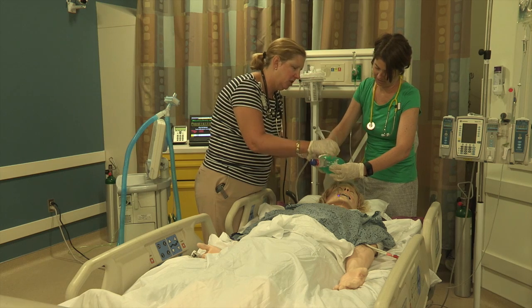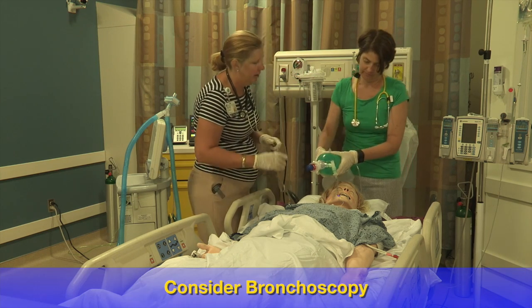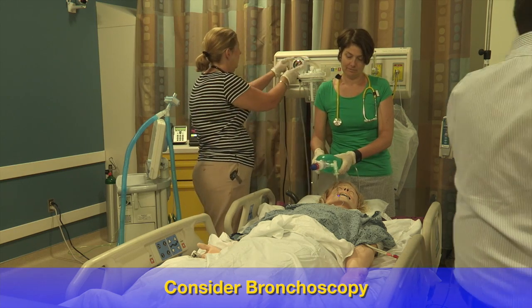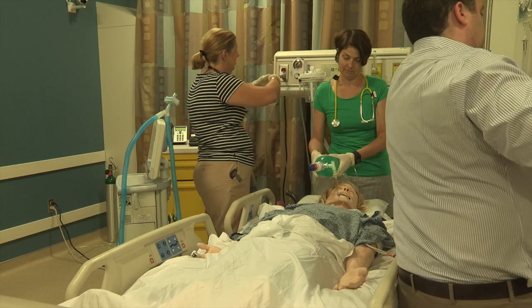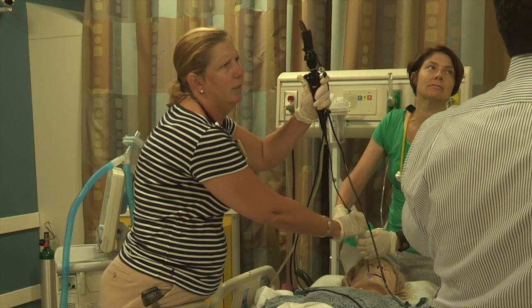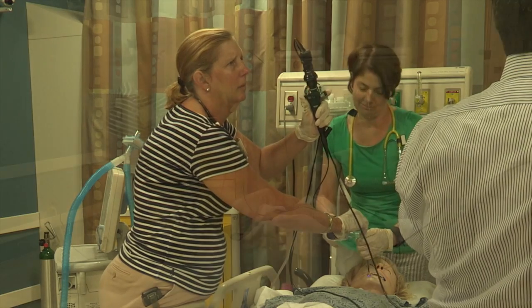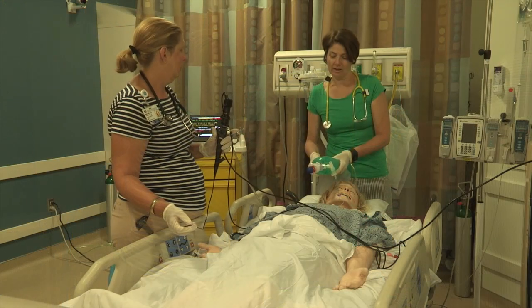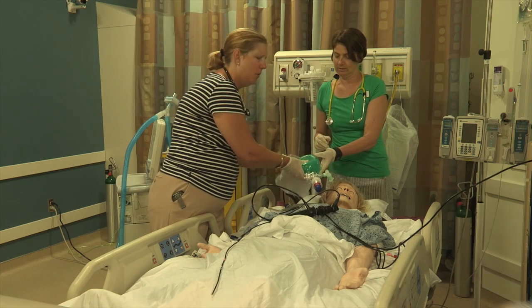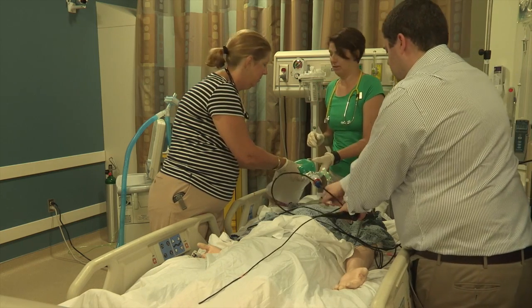There we go — the bronch adapter is sometimes tricky to get past. She's got just a ton of secretions; I think we're going to need to do a bronch to get that out. Hey Jack, can you come in and give us a help? We need to bronch this lady. Look at that right middle lobe — it is full of stuff, totally plugged. That's markedly improved — absolutely. Those sacs still aren't coming up though.